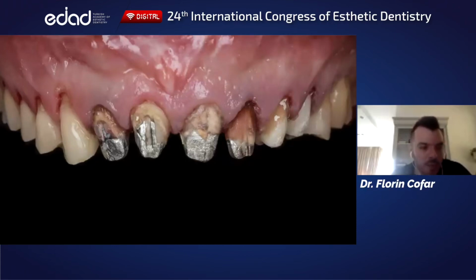Even if you layer a little bit, don't think that 0.1 or 0.2 doesn't matter. It does, because you can get to an extreme level of precision in the virtual, and the problem is the manufacturing method. Technically you have to opt: do I go for shape and then it's monolithic, or do I go for optics and then you have some adjusting to do in terms of shape, and you lose a little bit of the plan.